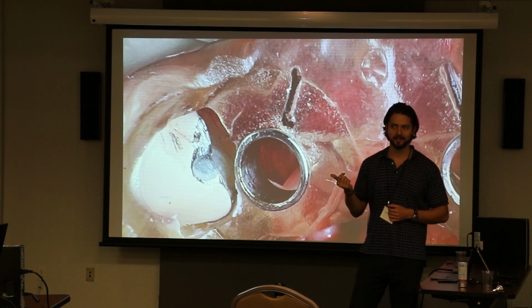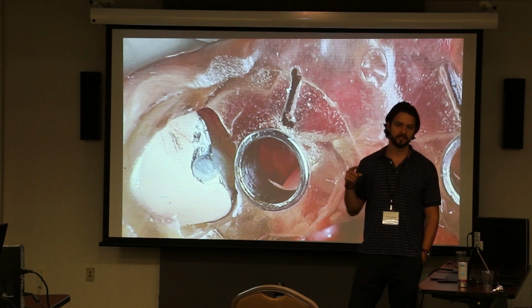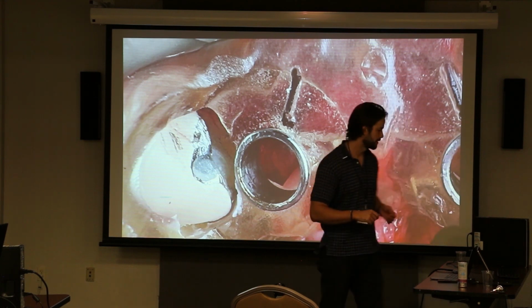For my first case, I was a little bit ignorant about the subject, and I was like, you know what, I planned the implants, I have a guide, timing, I'll just take a look inside and see. I also pre-printed a pickup that same day. So the anterior ones are just fine. They're straight 0 degree multi-units, so it doesn't matter where your temporary cylinders are. The posterior ones were 30 degrees, so playing around with angulation, I really had to bore out the model I pre-printed to pick it up, because those original pickup holes I made through my denture were not lined up anymore, just because the timing was off. It wasn't accounted for in the guided surgery.